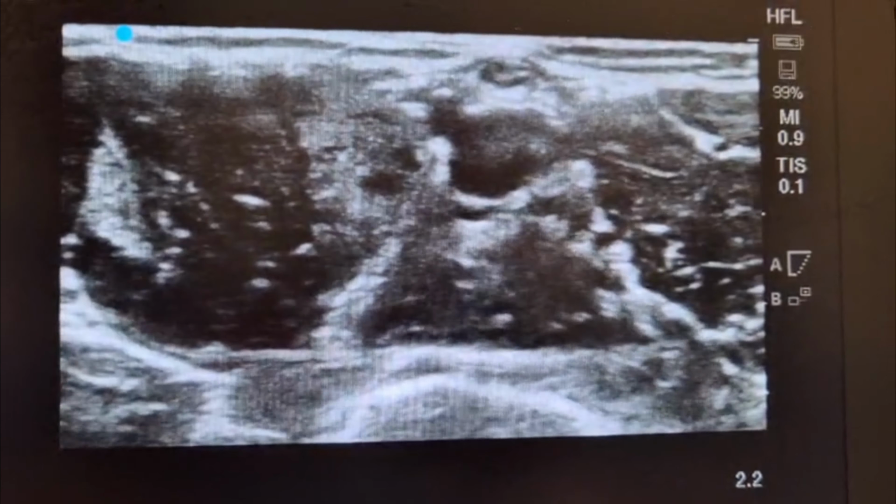Okay. So we'll get a few mils there, so we'll spread the other side. I think that should be enough. Let's come back to the skin and go to the medial cord now. Just under the skin, almost near the skin, and adjust it and go straight. Yeah, that's it. You adjust it. Yeah, that's a good angle you're going, yeah? Because we want to go just under that layer. Just under that layer, and we will start hydrodissecting.